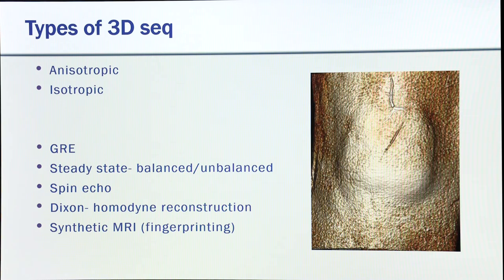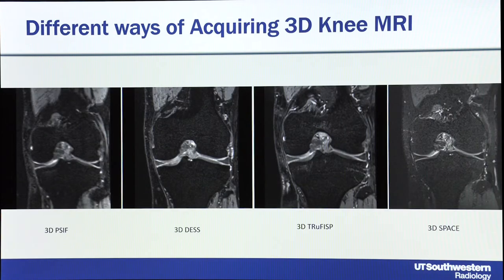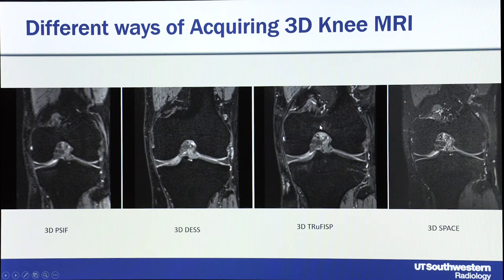The most well-accepted approach is the 3D spin echo type — in this case the Siemens variant 3D SPACE. There's also the true FISP, which is the balanced steady state; 3D DESS, a combination of gradient echo and spin echo; and 3D PSIF. On the true FISP there is some artifact in the bone marrow so you can't tell if it's real edema or normal. For cartilage differentiation — the deeper layer being darker, superficial layer wider — it's hard to appreciate on DESS, so we prefer the 3D SPACE or 3D TSE sequence.